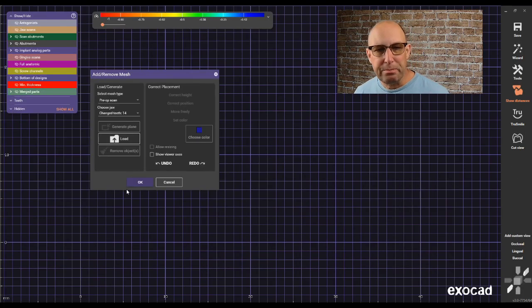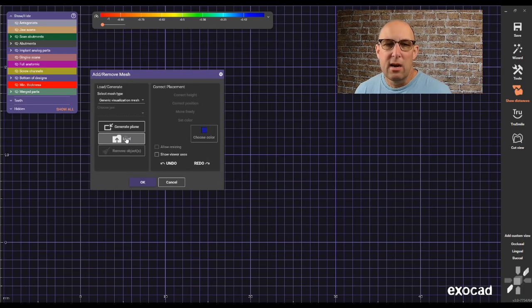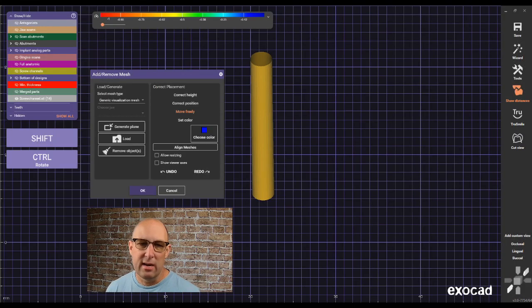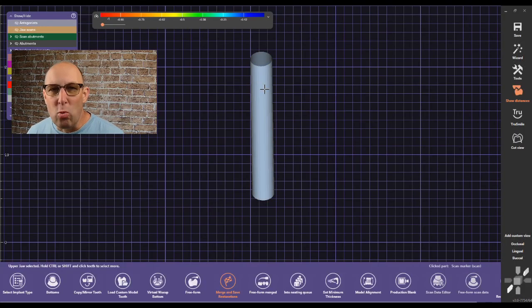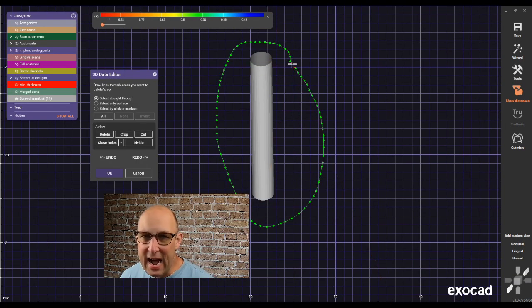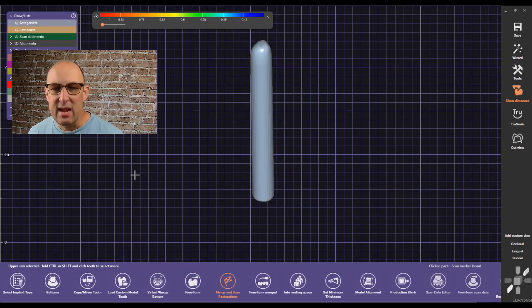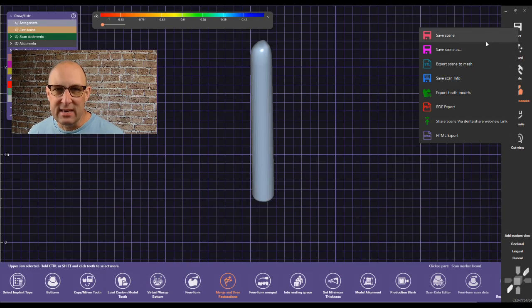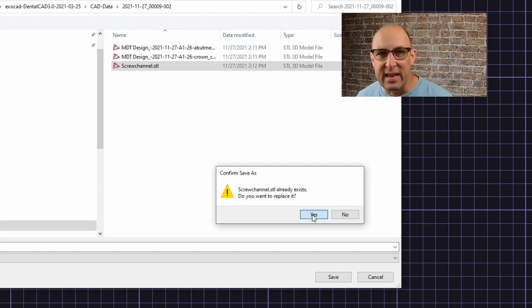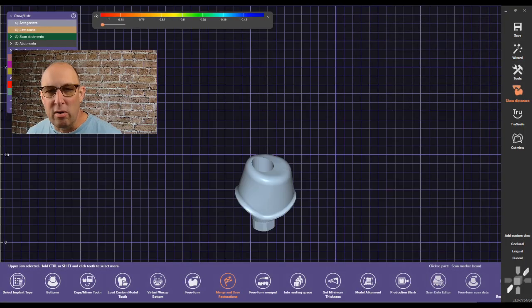Then deactivate the screw channel and import it — click Add and Remove Mesh, and use a generic mesh to import it. Load the screw channel STL you just exported. Click OK, right-click on it and hit Edit Mesh. Select the entire screw channel, close the holes, and click OK. Output this again — you can override the screw channel STL you already created. Click yes to override, click yes, and use the original coordinate system.